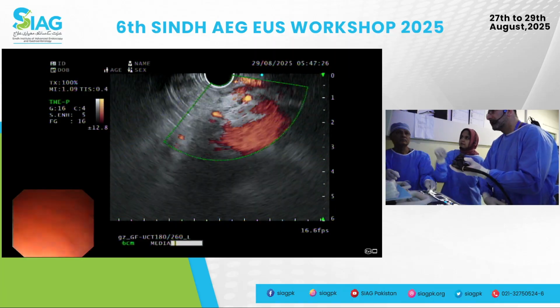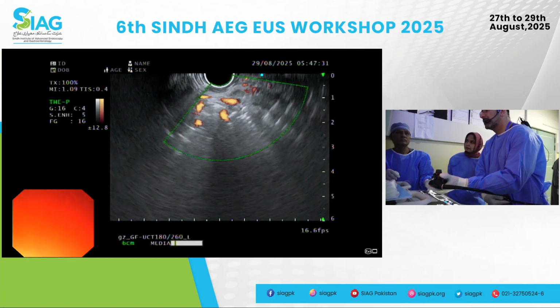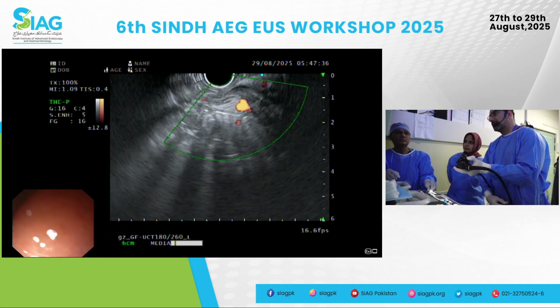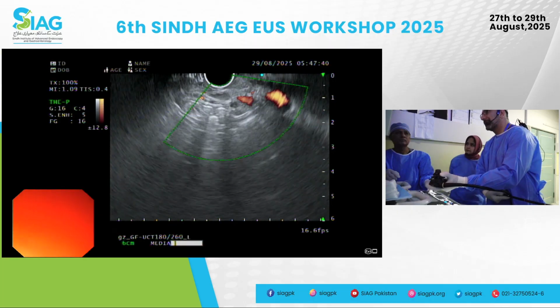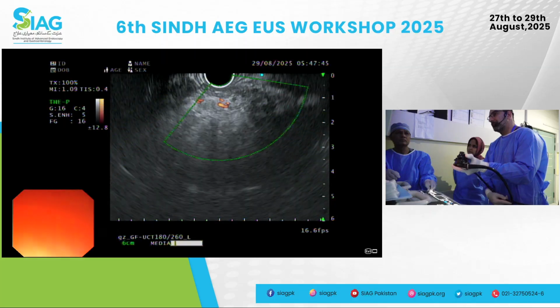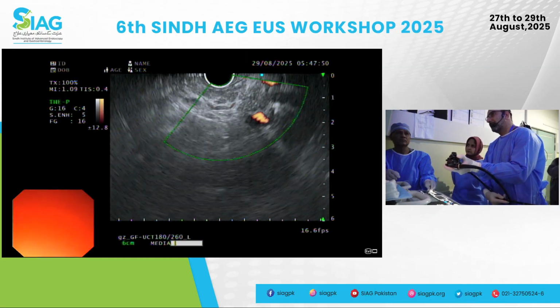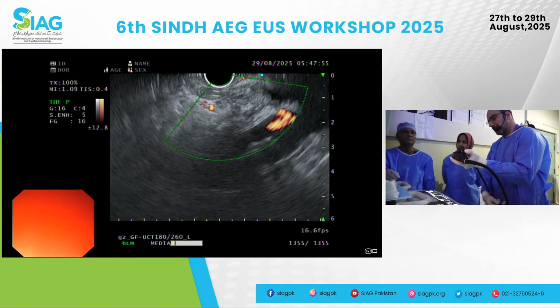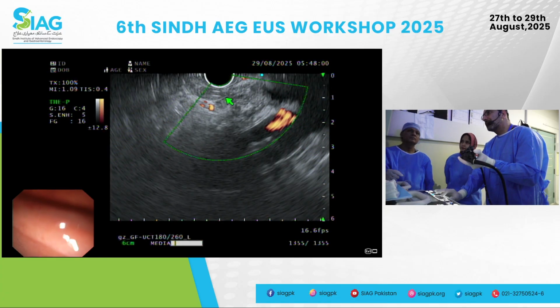Yeah, briefly. There's your bile duct, and if you go clockwise, you would expect to see the stent. But it's right there at the top. So I'm going to maintain that view, and here it is coming. Freeze it. So now we have our stent at the top, coming into the duodenal lumen and going into the pancreas.